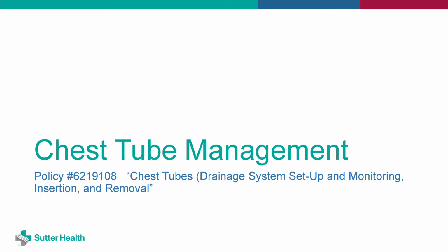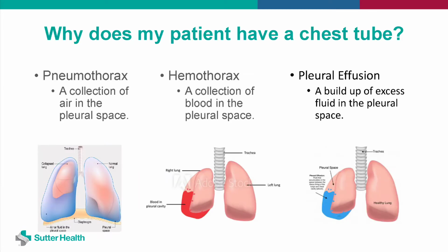Chest tube management. This training will cover why a patient has a chest tube, how the drainage system works, and what to do if there is a dislodgement. Why does my patient have a chest tube?